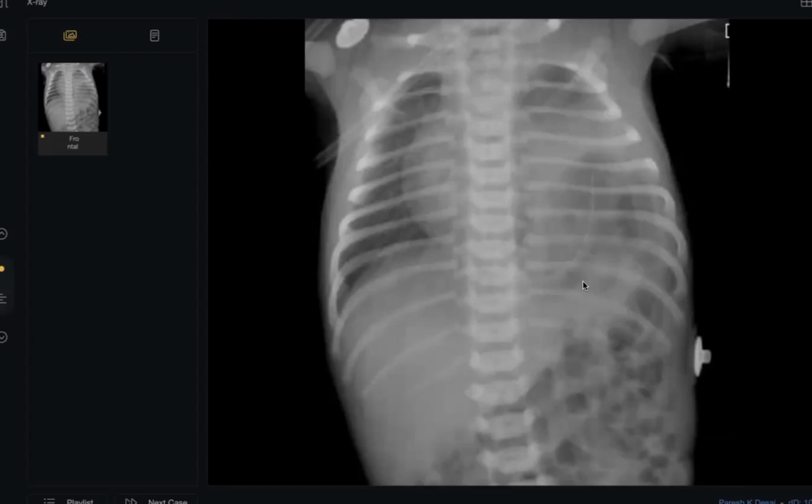No barium. A simple test, a simple examination. Decubitus, I don't think so. No. Do you have a stethoscope? Sir, which scope? Stethoscope. Oh, yes. If you put the stethoscope here, you can listen to the bowel sounds.